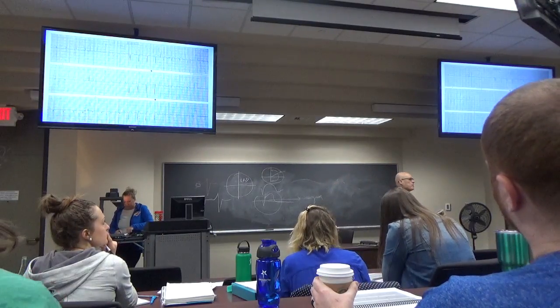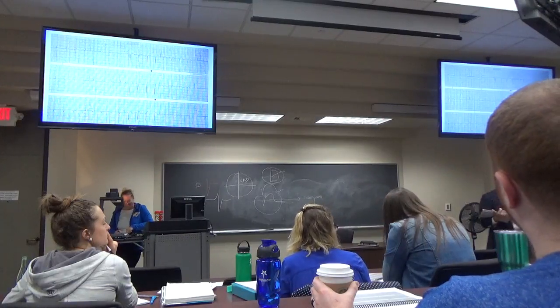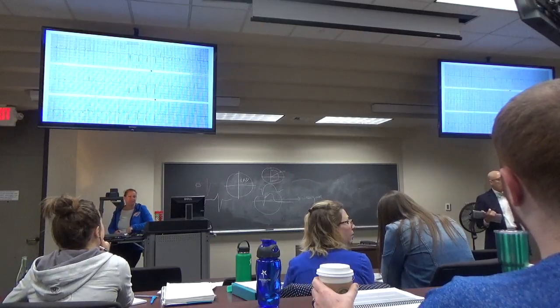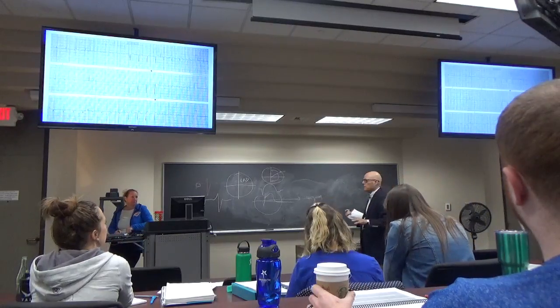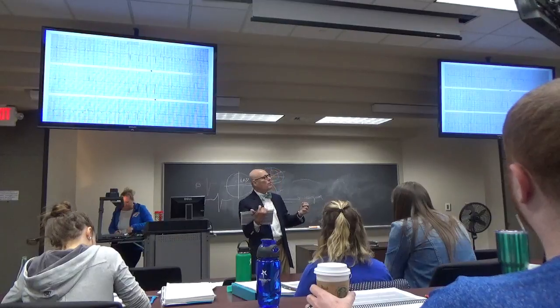Greater than or equal to 0.2, mm-hmm. Or is it just greater than 0.2? You mean for a bundle branch block? Or AV block? 0.20. Oh, that's not greater than or equal. Are you talking about bundle branch block? No. First degree AV block. Okay. So I think most authors say greater than 0.20. Which is why I wrote down 0.20 to 0.21.